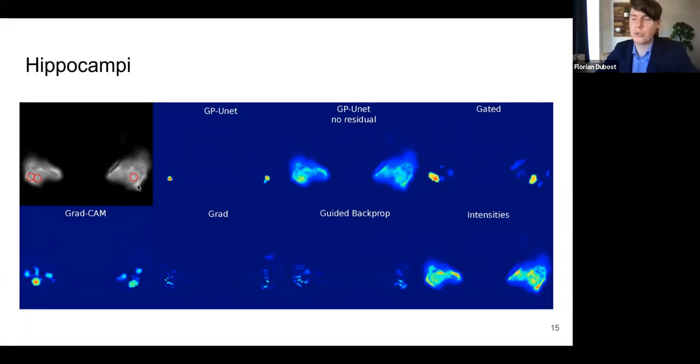So you're probably not used to seeing that if you're a radiologist, because what I did is that I used some FreeSurfer parcellation of the brain in different regions. And then I created some sort of smooth mask and I applied that to the image so that I can only get the part of the image that is relevant for the task. The idea behind this is that I give some prior knowledge to the network in the sense that, okay, you only need to look at this region, don't look at perivascular spaces elsewhere. So this is easier to optimize the networks. And that's what I'm showing here, the masked brain region. So this is part of the hippocampi, and then you would scroll up and down to see it as a 3D volume. So this was given as a 3D volume.